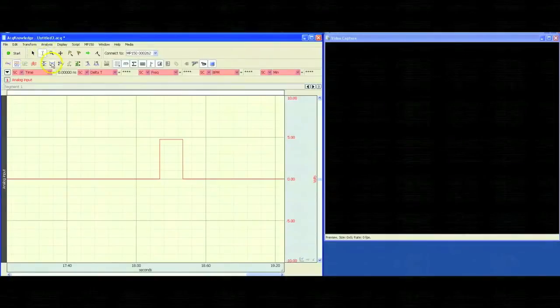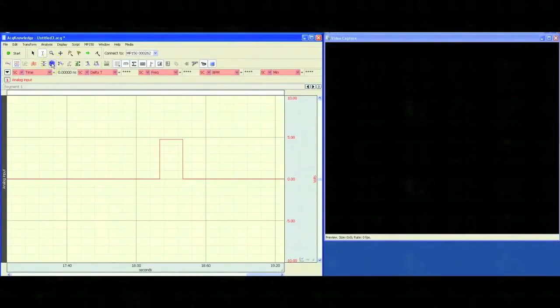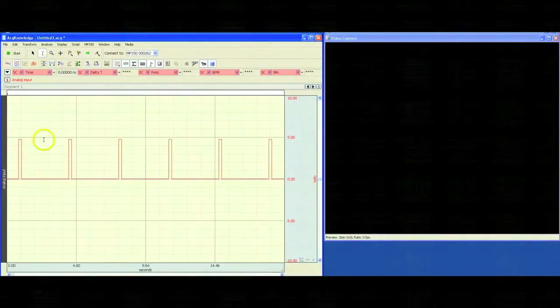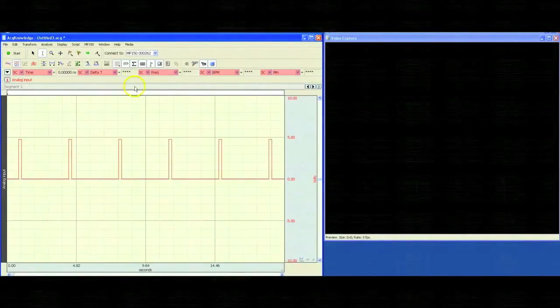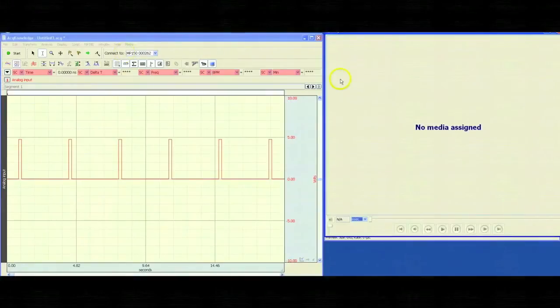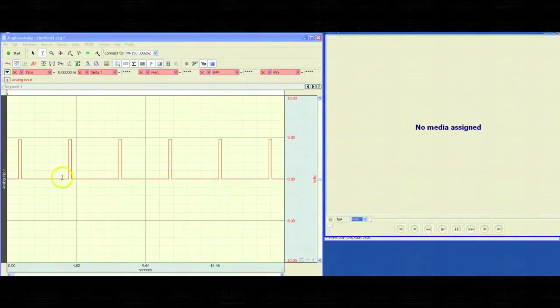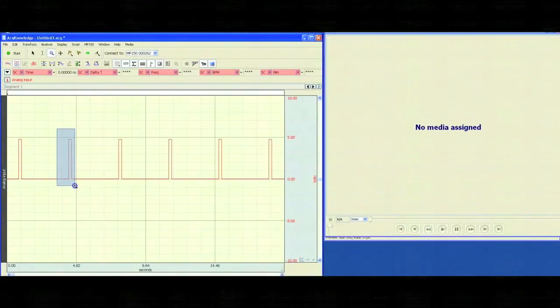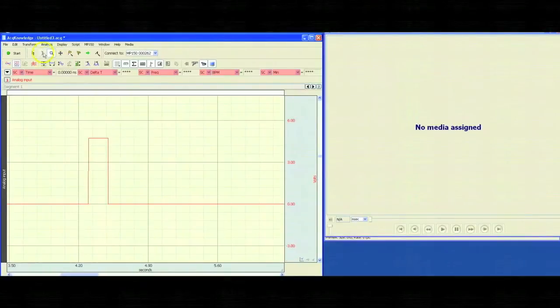Now, we can auto-scale horizontal to show all the pulses we just recorded. Now, we can switch to our playback window, and we can zoom in on a specific pulse.